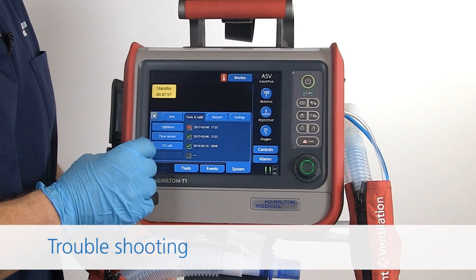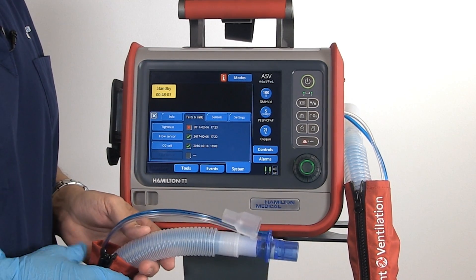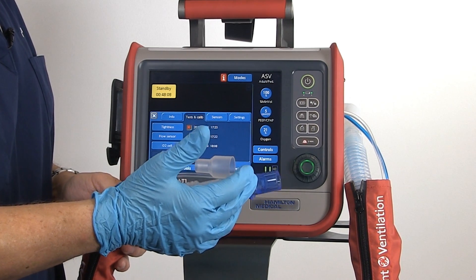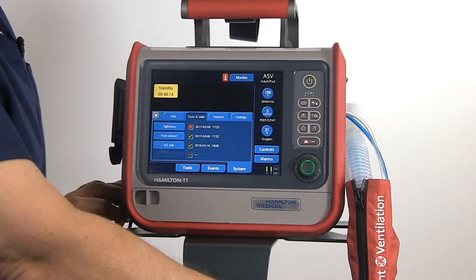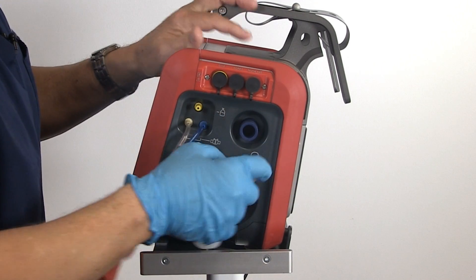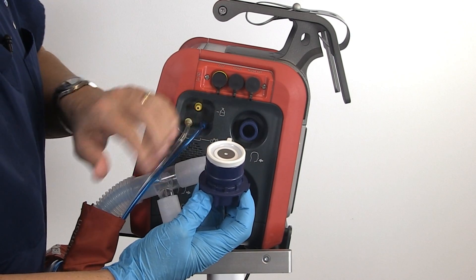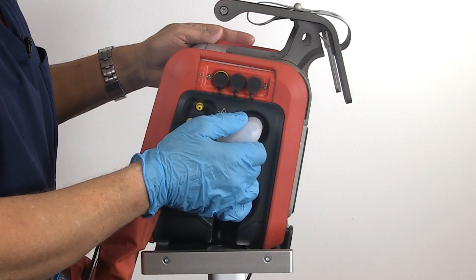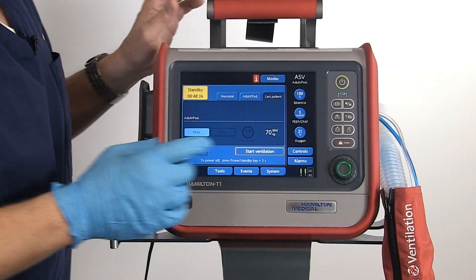If you received a red X in either one of the boxes, that indicates a failed test. At this time, you should check your circuit from the flow sensor all the way back to the ventilator to assure all connections are tight. You should also remove your exhalation valve, check the membrane for proper positioning, reinsert it and tighten it. Then attach your circuit and rerun your pre-op checks.